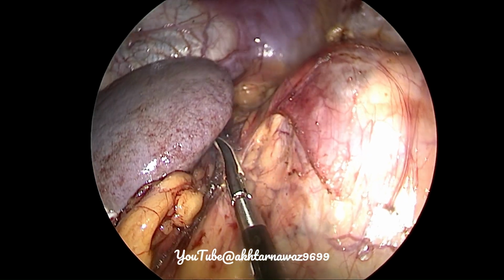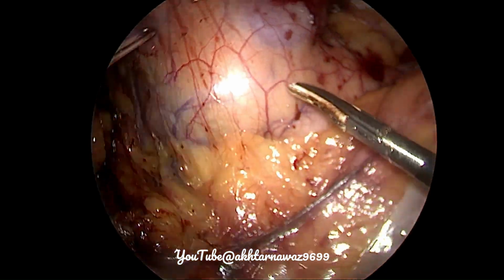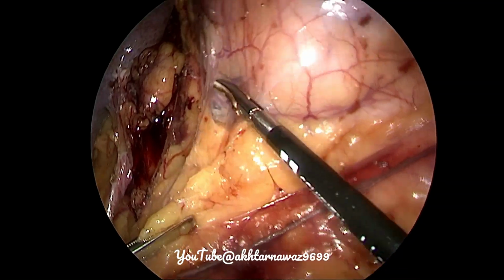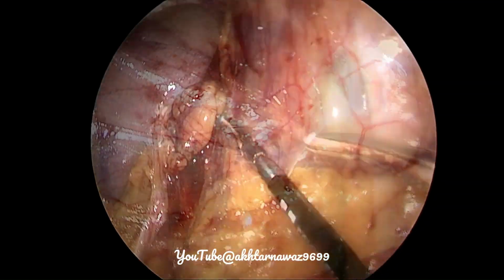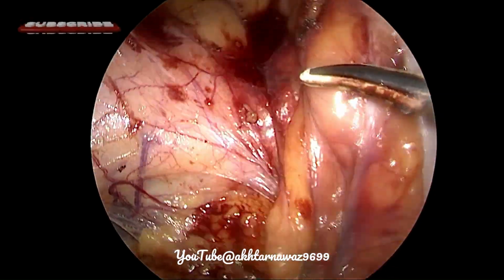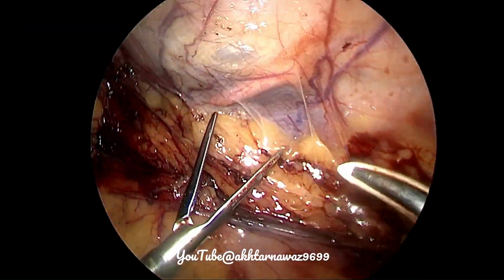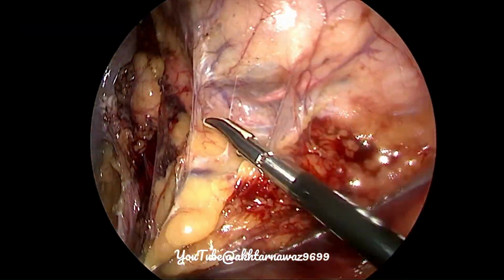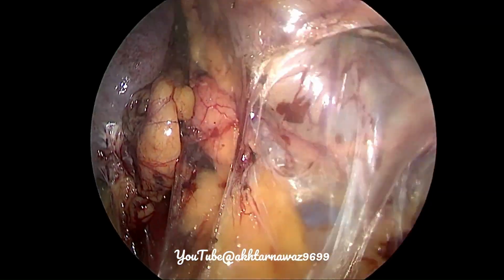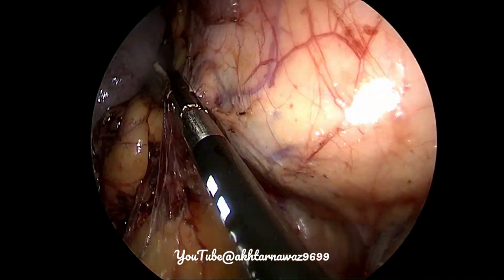Today we are discussing left-sided renal parapelvic cyst. The mobilization of the colon is the same up to the crus of the diaphragm, so that the gut falls down, and from that level up to the sacroiliac joint. And then we try to identify the ureter. In this case, we performed a left retrograde study, and we also placed a DJS stent into the upper calyx so that injuries to the pelvic calyceal system are avoided.